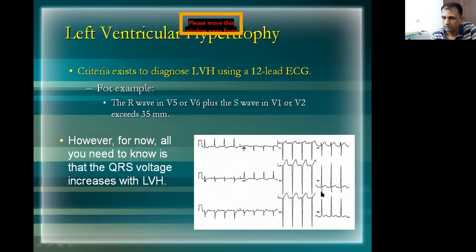Okay, R wave. So we discussed the Q wave is the first negative point, and the R wave is the subsequent tall one, and the S wave is anything that goes below the isoelectric line.